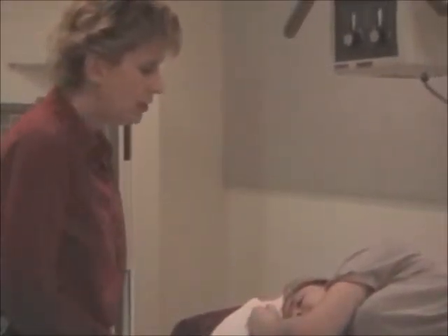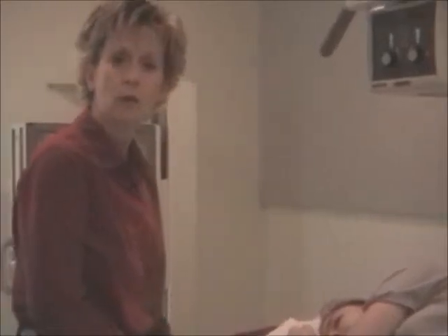We're going to move on now to a stomach exam, and since our patient's in a right lateral position, we might as well position for a right lateral. Again, I'm going to demonstrate these not in any set order. If your patient is left in a supine, AP position, you would start with your APs first.